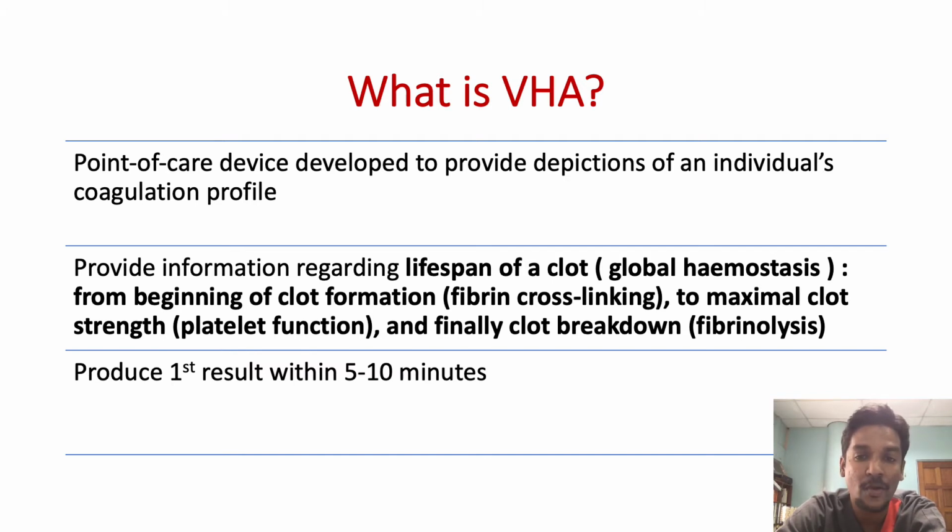It tells us how fast the clot starts to form, during which clotting factors and fibrinogen are responsible, what's the maximal clot strength, which indicates platelet function, and also it tells us how fast the clot breaks down, or whether or not there is presence of hyperfibrinolysis.